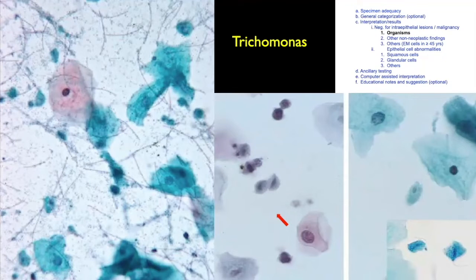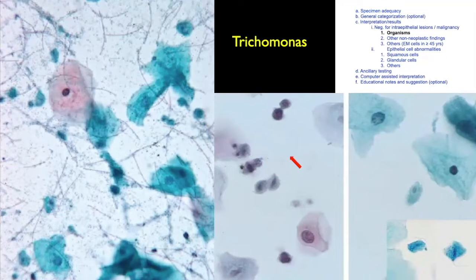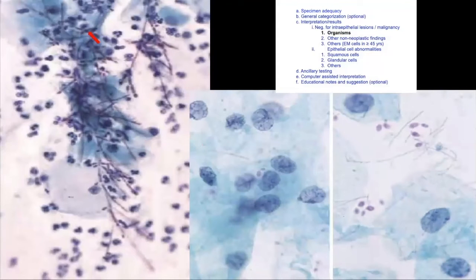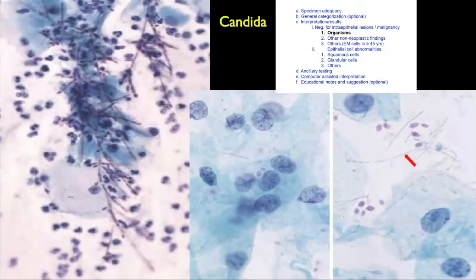Whenever you see a lot of neutrophils, that does not automatically mean inflammation — you have to look for epithelial changes. See the perinuclear halo: these organisms eat up the glycogen around the nuclei, so look for perinuclear halo and pseudo-orangeophilia. Here you can see what I describe as a 'kebab' pattern — budding yeast with pseudo-hyphae, which are not true hyphae. When you see yeast and pseudo-hyphal forms together, it is characteristic of candidiasis. Sometimes naked nuclei of neutrophils may mimic Candida organisms.